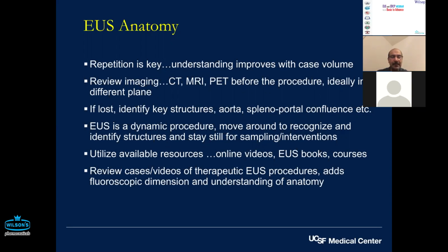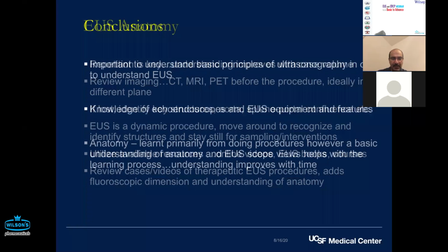From my perspective, a lot of my learning obviously was with mentorship from my seniors, but interestingly, fluoroscopy I find really helps understand anatomy, because you're doing EUS and you're also injecting contrast, and all of a sudden things light up and make sense to you. So it's a backwards way of learning. You can't teach trainees by starting with interventional EUS, but as you do more and more interventional EUS as time goes on, that further enhances your education.